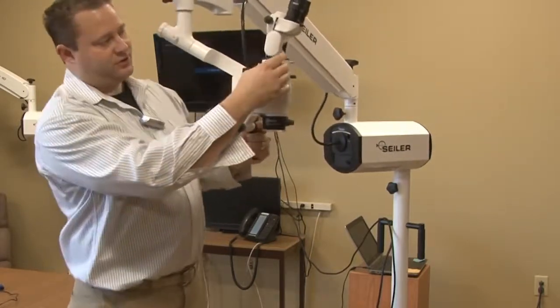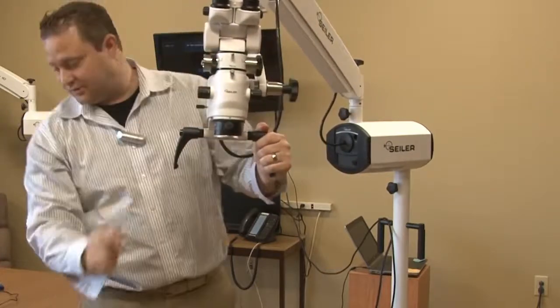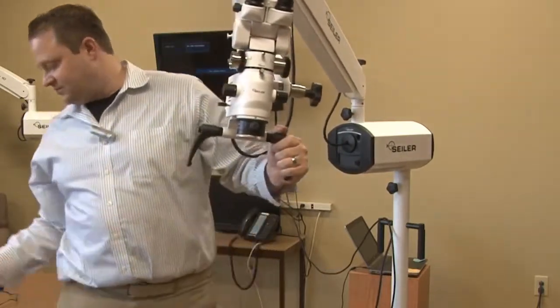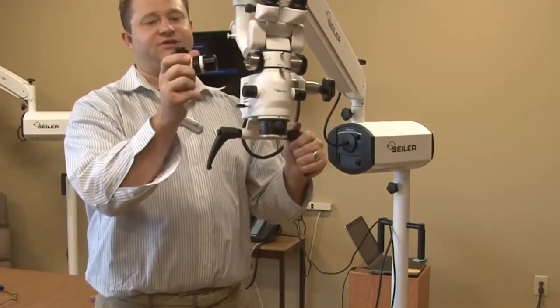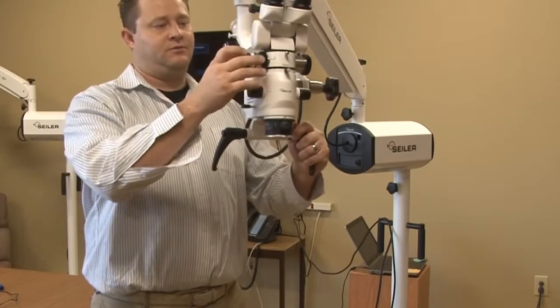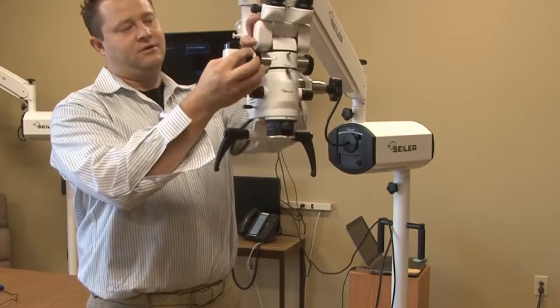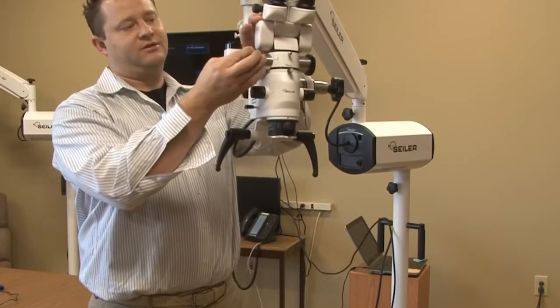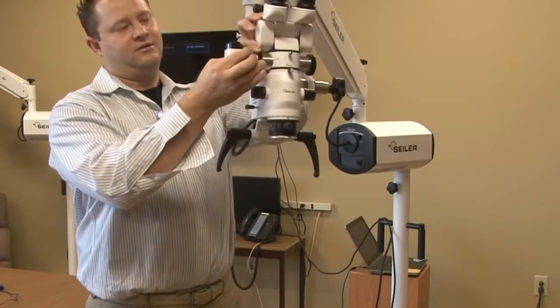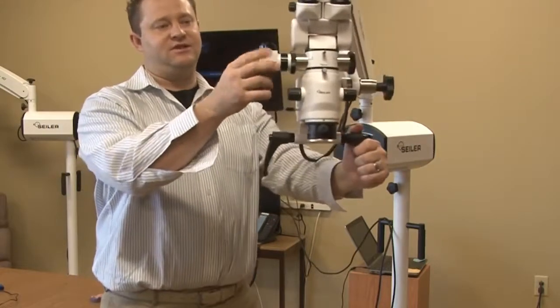Now we're going to go ahead and put the HD adapter onto the beam splitter. Typically this is just a C-mount adapter. Lock it into place, and take the black ring and lock it as well so it secures the CCD adapter.